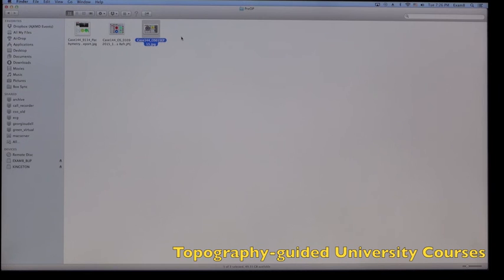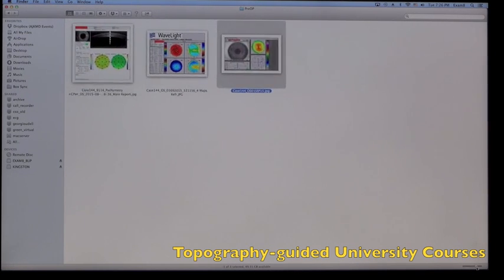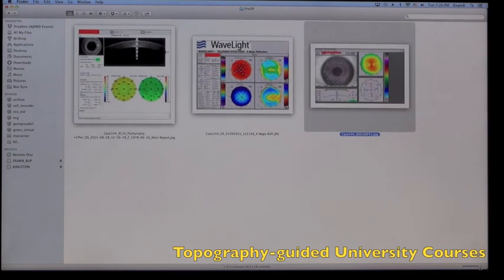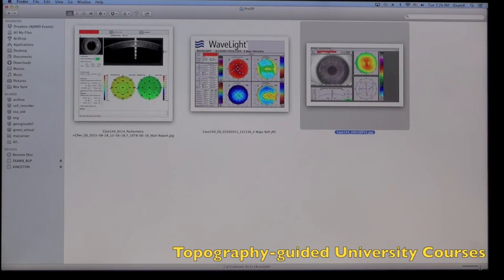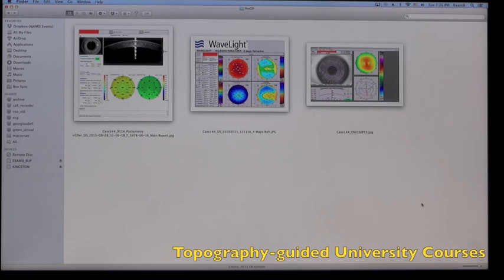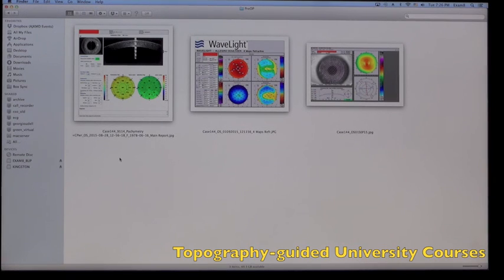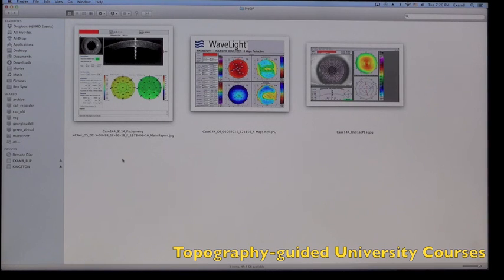So here in the pre-op information we have, almost in all cases, a placido disc topography you can see here on the right, a pentacam topography in the middle, and an OCT anterior segment scan which shows cornea thickness and an epithelial map.